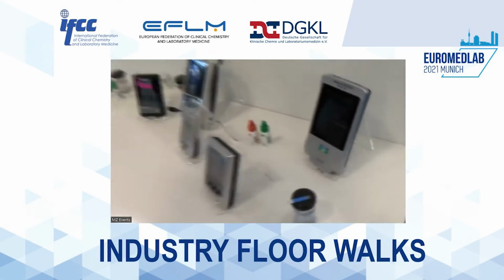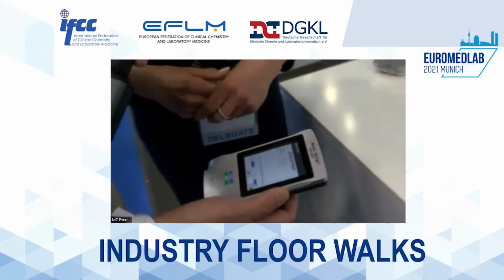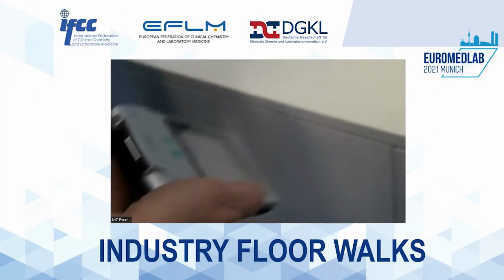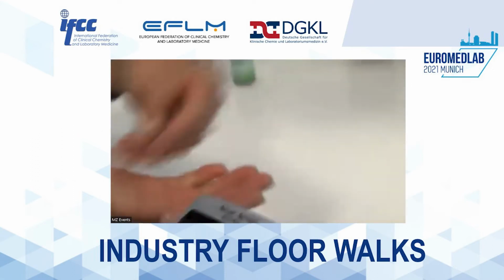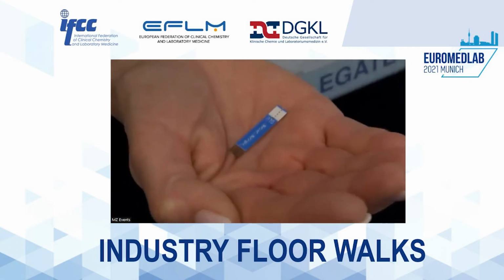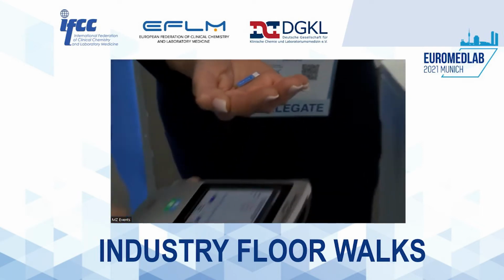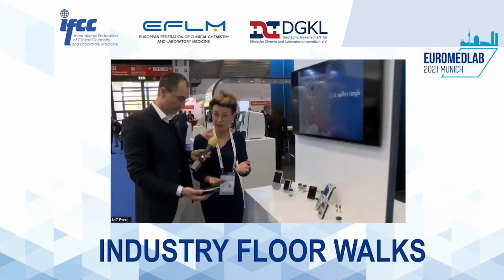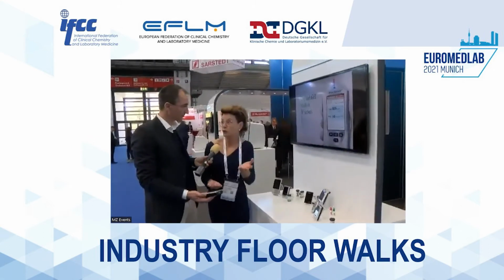This is interesting. May I have a closer look at these? Yes. At this device. So this is for glucose monitoring. And I think it's called the StatStrip machine. Yeah. And there's the entrance for these. This is the strip entrance. Can you show me one of these strips? Yeah. These are the strips, where you have the different wells for measuring the glucose. We're measuring the interferences, so substances that can interfere with the glucose testing and then give wrong results. So we measure that, and by an algorithm we deduct it, so that we can correct for the interferences, and it's just as easy as any glucose test strip system you know.